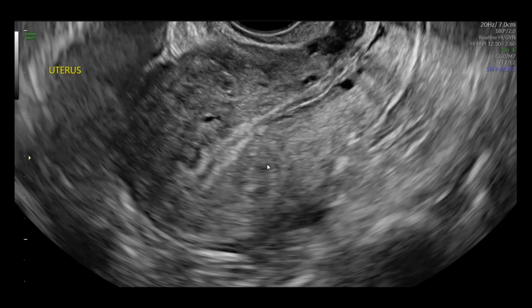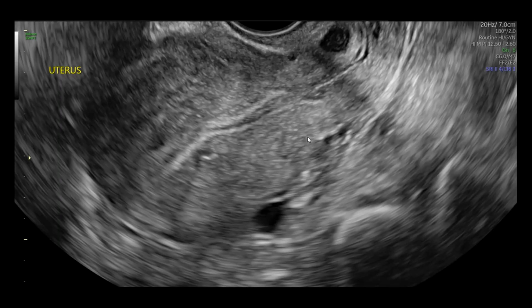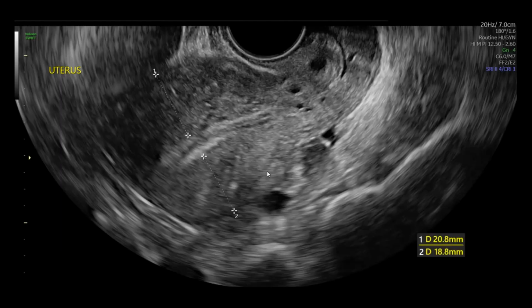So yeah, lots of adenomyosis. Maybe some lines here or some buds here as well, potentially. There's something that they're capturing here. This one's a bit more bright white, much more hyperechoic, so a little bit harder to interpret, but this very likely represents another depiction of an echogenic line.